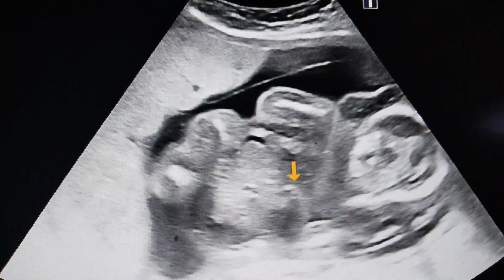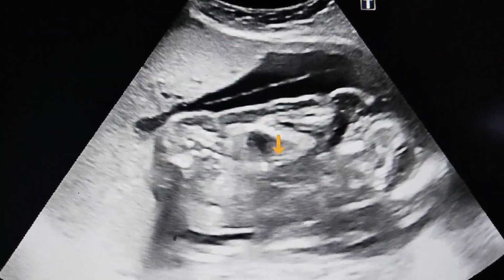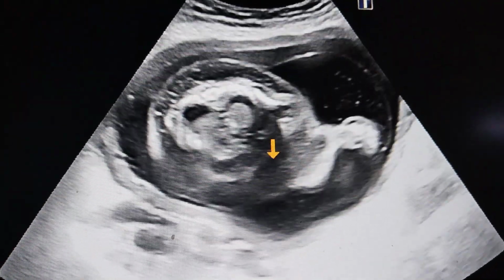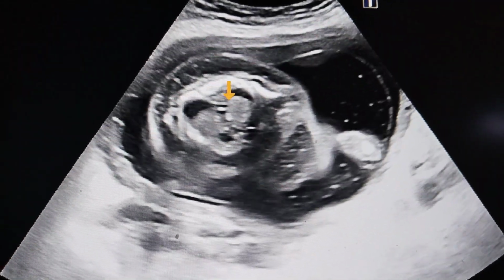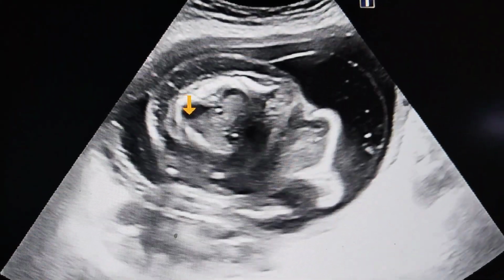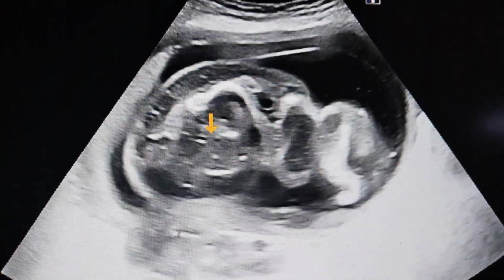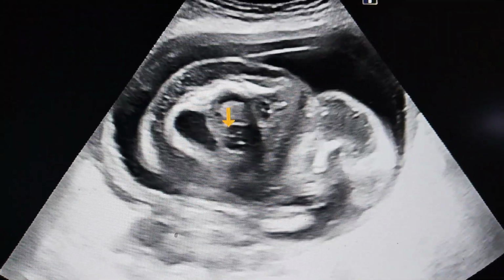So pleural effusion is present, and the white tissue is the lung. So bilateral pleural effusion is present. This is the fetal heart, which is displaced to the middle due to this bilateral pleural effusion.